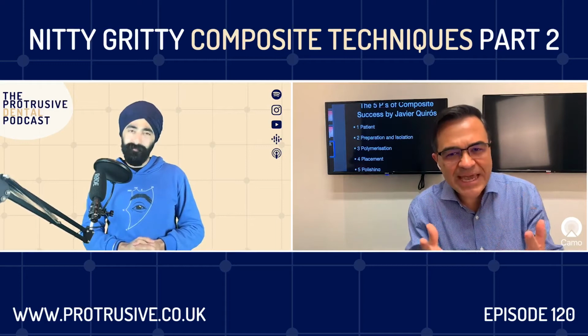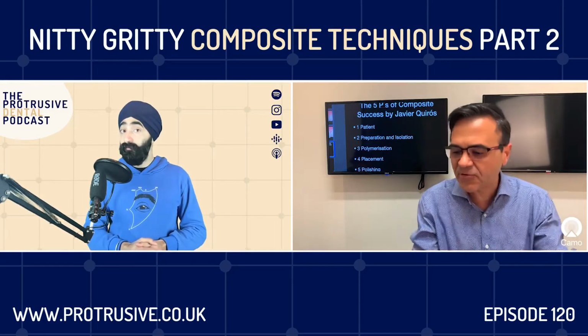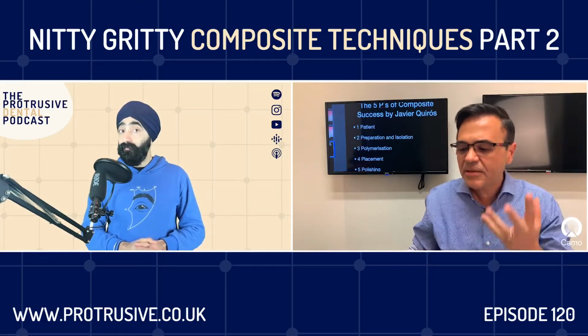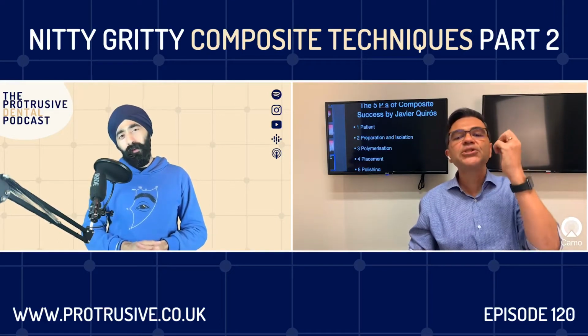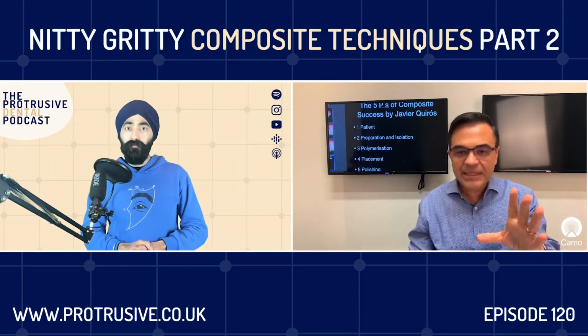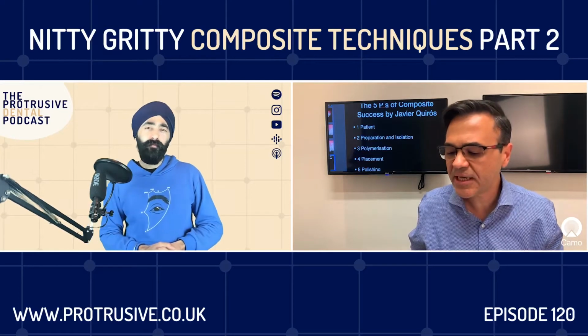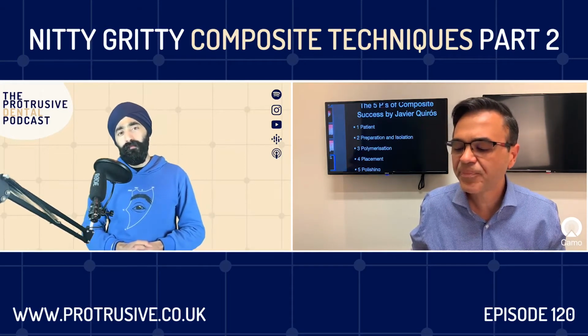Your patients that you already have in your office, they come every 6 months. Those are your perfect patients for composite veneers. Then preparation and isolation. Make sure you use a rubber dam. It's so important to isolate. It's maybe 90% of your success is because of your isolation.